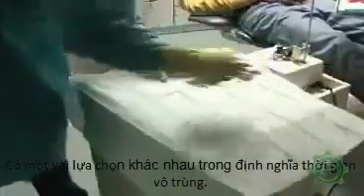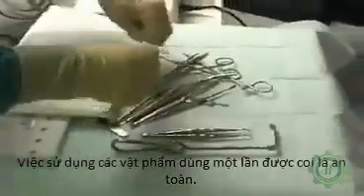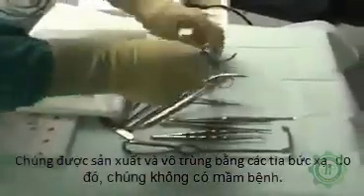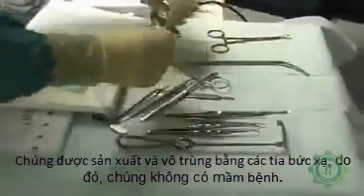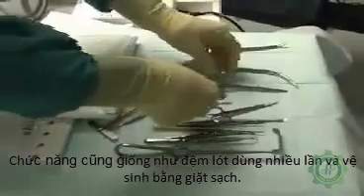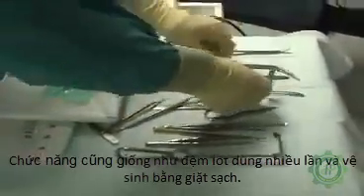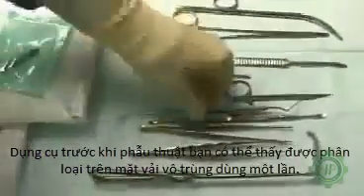There are different options in terms of sterile covers. The use of disposable articles is safe, as these are sterilized by producers through radiation and are thus free of germs. Prior to surgery, you see how the instruments are sorted on a sterile disposable cover that serves as padding.